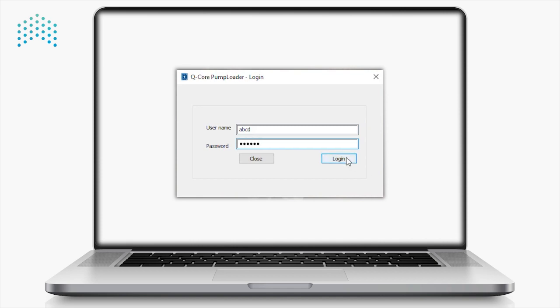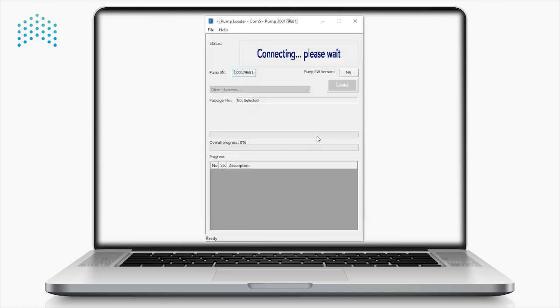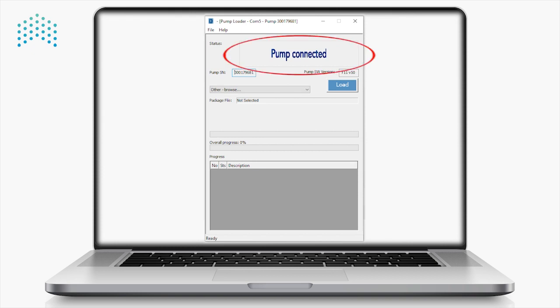After clicking on Login, the Pump Loader Communication Port Selection window opens. Select the appropriate port and press OK. The main screen of the pump loader will open. Wait for the status field to indicate that the pump is connected.